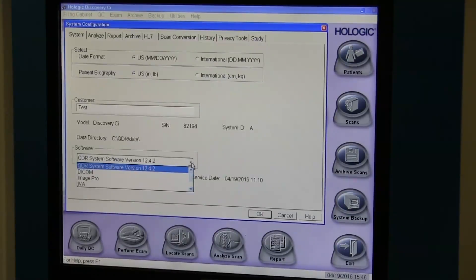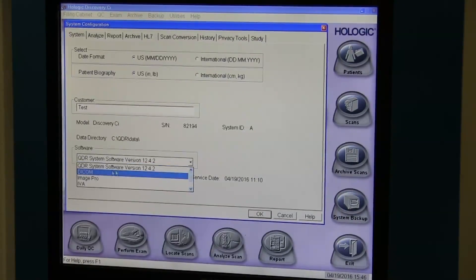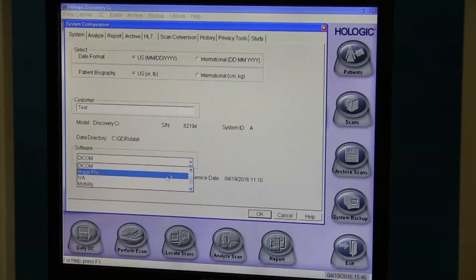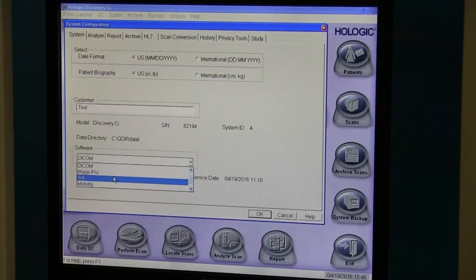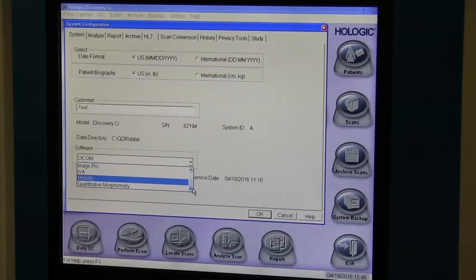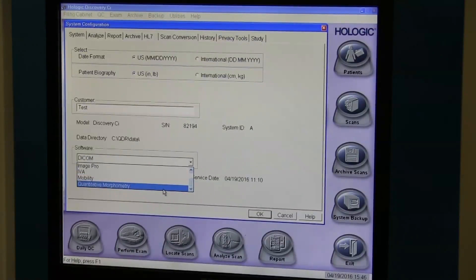As you can see with the drop-down menu, I've loaded the system software: DICOM, ImagePro, IVA, Mobility, and Quantitative Morphometry. These are the options that this system has.